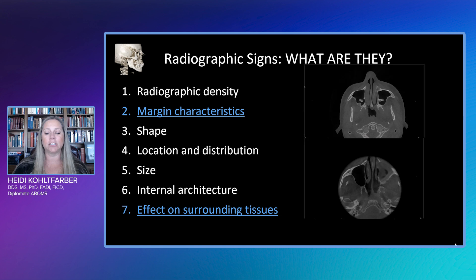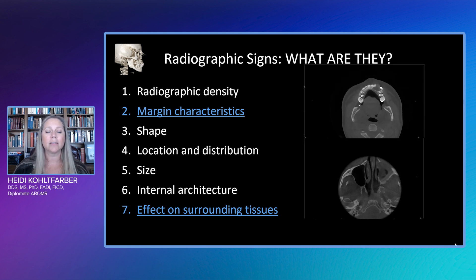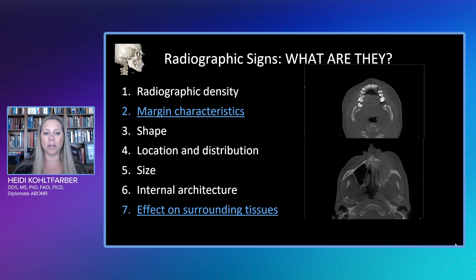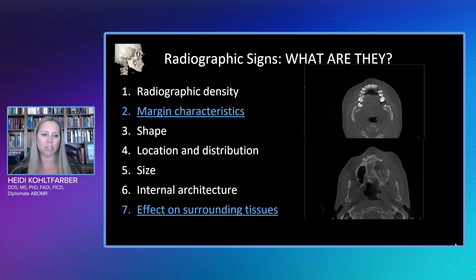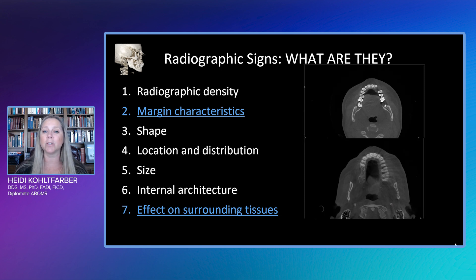One of the things I want to point out when we review a CBCT is we want to look at our radiographic signs. So if you do find a lesion, these are the radiographic signs we're going to look at — keep these in mind as we go through the case. We can see radiographic density, marginal characteristics, shape, location and distribution, size, internal architecture, and effects on surrounding tissue. We're going to look at all of those things as we go through the lesion in the volume.